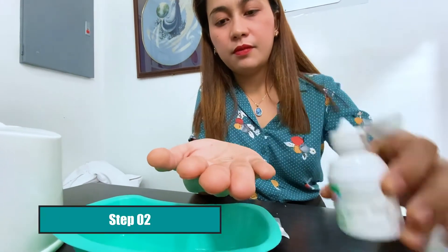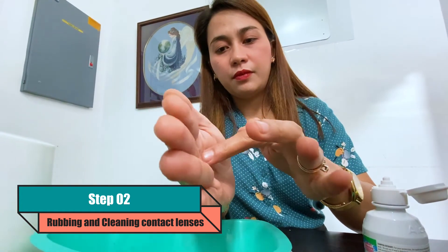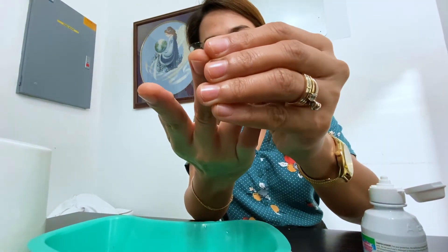Second, rub and clean your contact lenses with disinfectant solution to break down protein buildup, remove any foreign bodies on them, and kill some of the bacteria on your contact lenses.